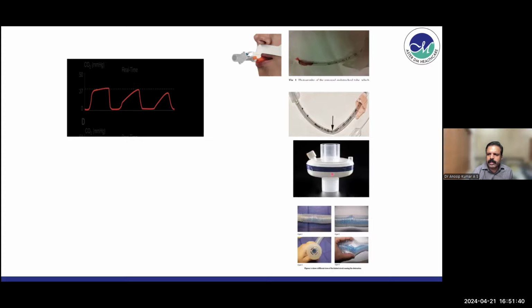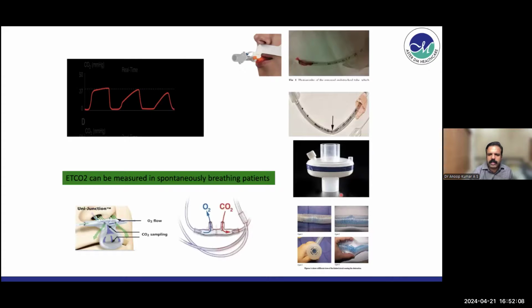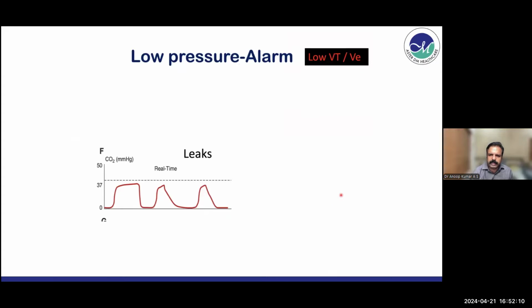This is very important. You should all understand that. Whenever you nebulize the patient on a ventilator, never use this HME filter. So if you keep it before this circuit, all the humidified vapors will get absorbed here, and the hygroscopic material in this HME filter will get clogged, and the resistance will increase, and even changing that will immediately improve the airway pressures.